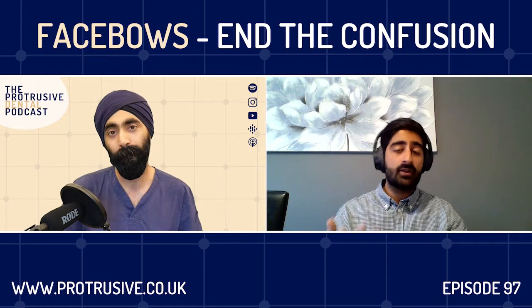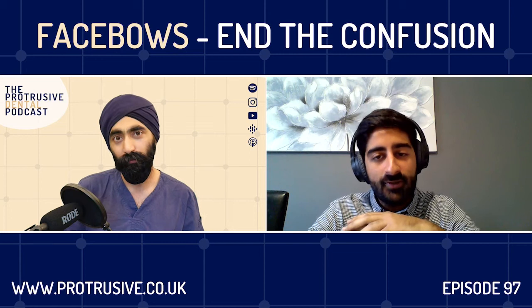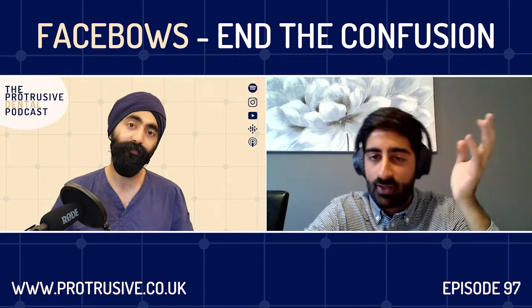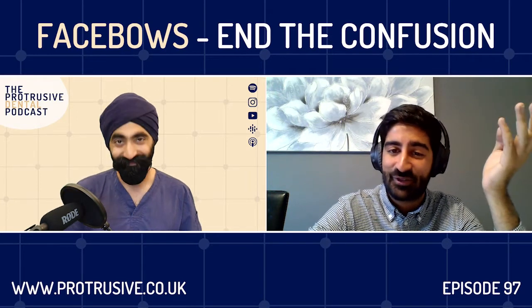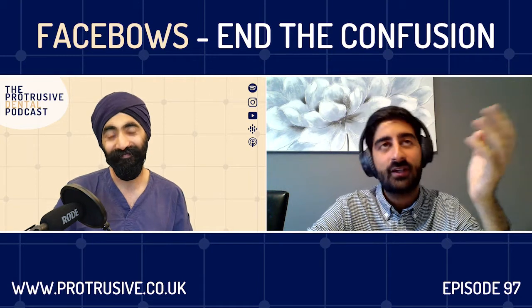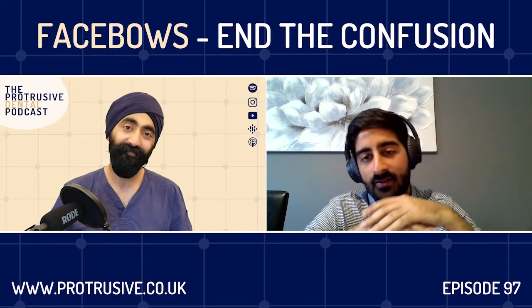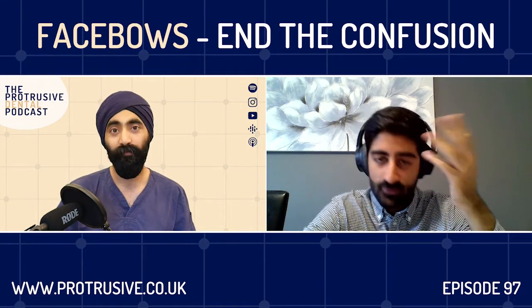Yeah. All I was going to say is, we've talked about Facebows a lot, but people will ask, when do you mount casts in intercuspal position, and when do you mount them in that retruded axis position? And that brings up a whole other podcast, I guess, because it's a huge topic. But essentially, you can plan a lot on an articulator. So if you can mount casts in that retruded axis position, which is that hinge movement of the patient, you need a Facebow to do that.